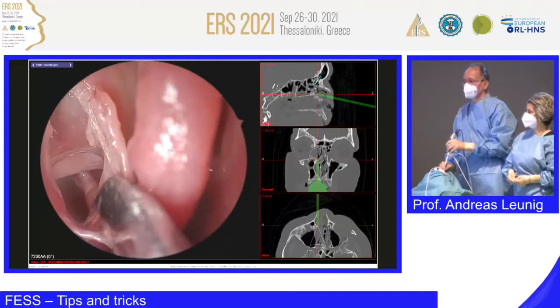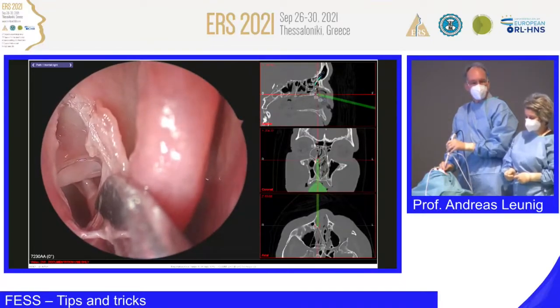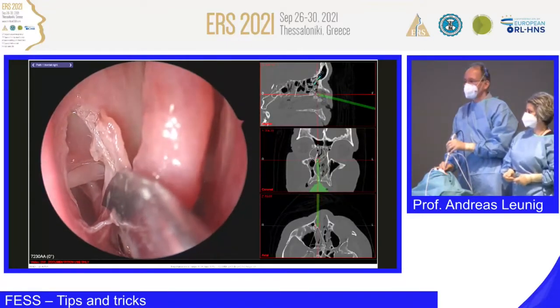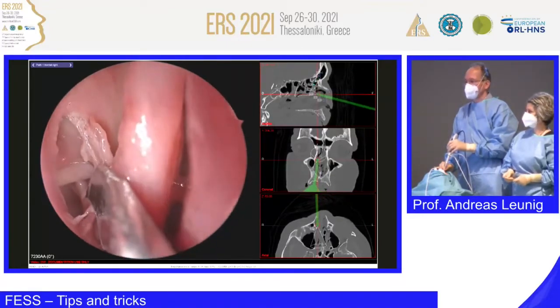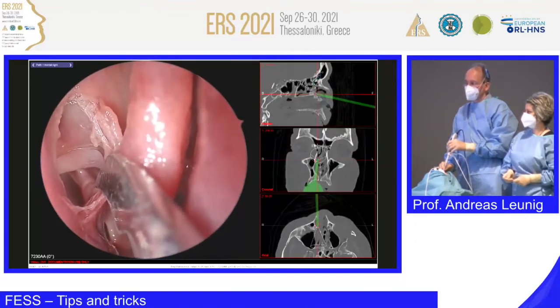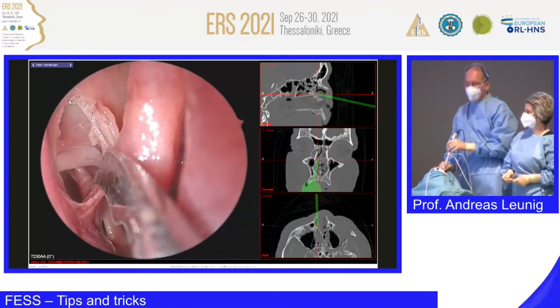Have a look here. What is the hole? What is the opening? The natural ostium. This is your focus. This is the concept of Walter Messerklinger and Heinz Stammberger. Can you see the opening up there, the natural one, and the accessory ostium, and this is the relation.